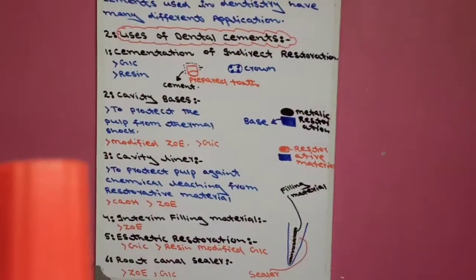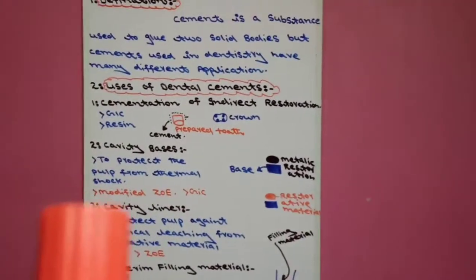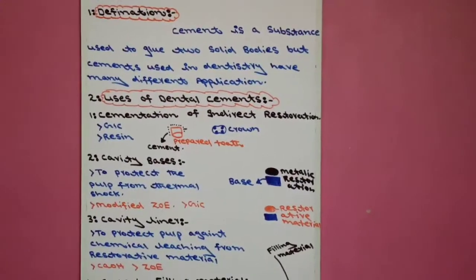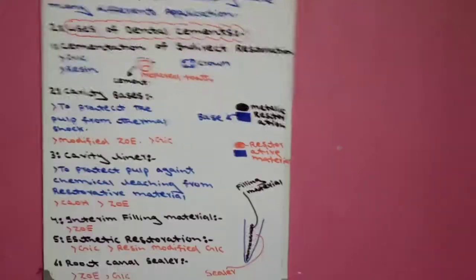Now come to the second use. The second use of the cement is as a cavity base. What is a cavity base?